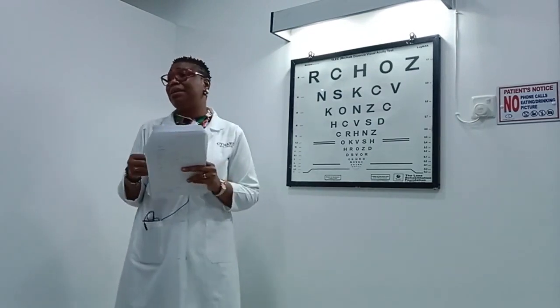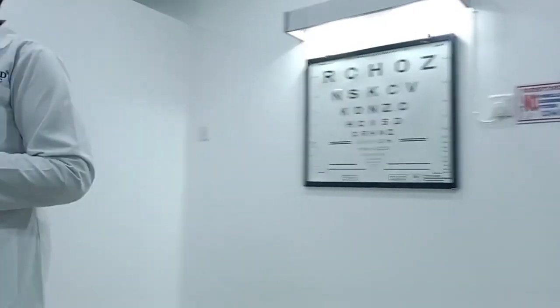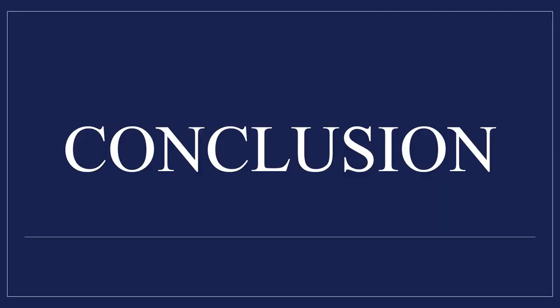So we check our devices, what we have in the clinic, what is available, and let's see how this can take her to 0.1 logMAR on the charts. Okay, so at the end of the day, we're able to make out what she needs to be able to carry her task out efficiently while at work.